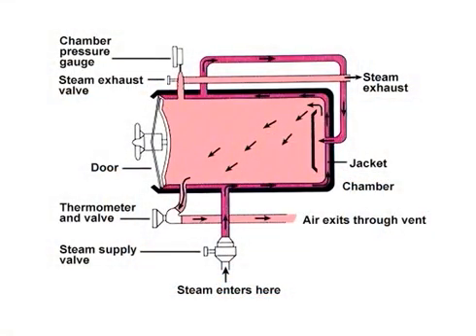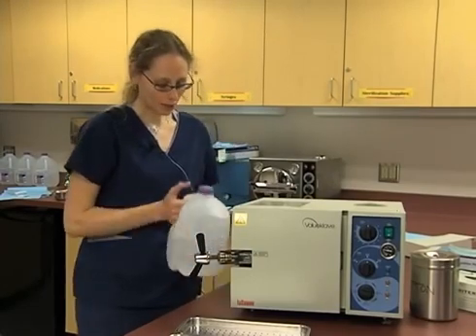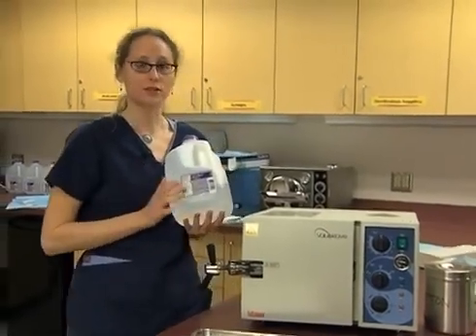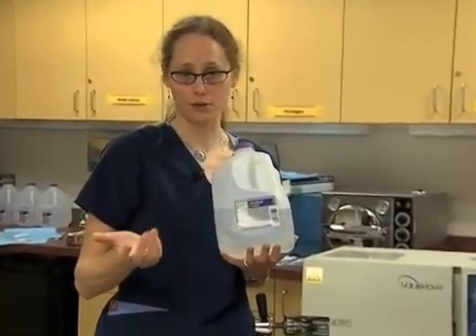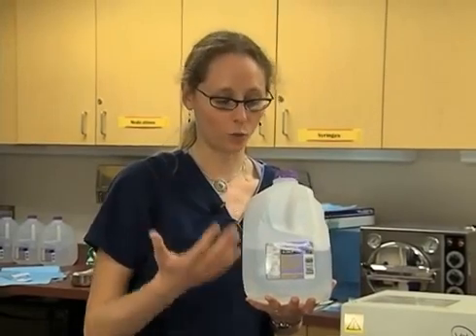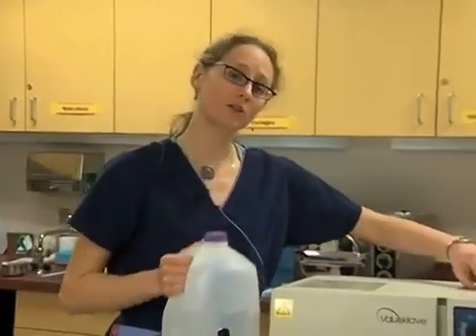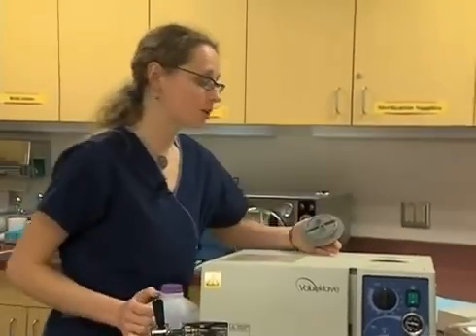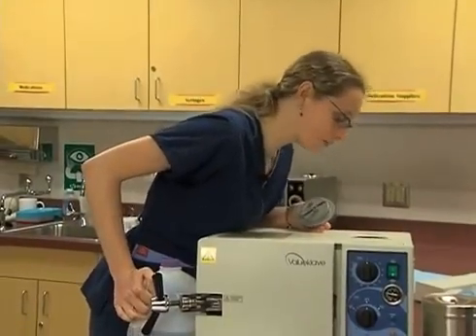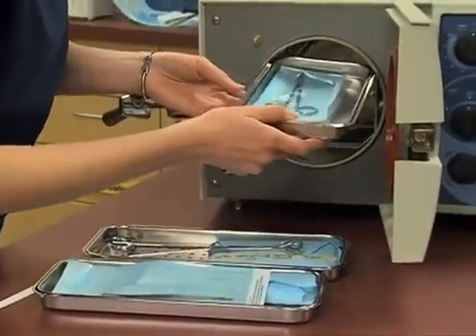The process of autoclaving is based on steam being pressurized and superheated above boiling temperature. So we want to make sure that there's plenty of water inside the autoclave. We can't just use any water though. We need to make sure that we use distilled water, because tap water can have other minerals or other material in it, so it may not work well and it may harm the autoclave. Each time we go to use an autoclave, we want to check the water level and make sure that there's plenty of water in there. Once we know that there's enough water, we're going to load our autoclave.